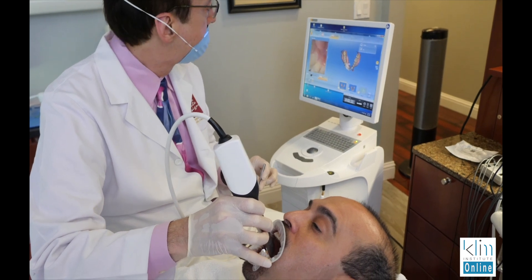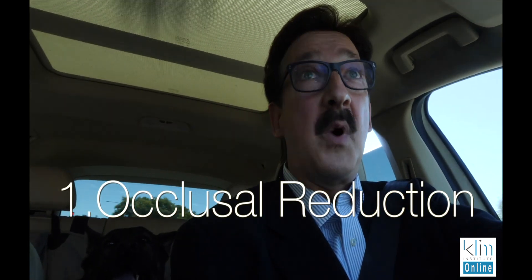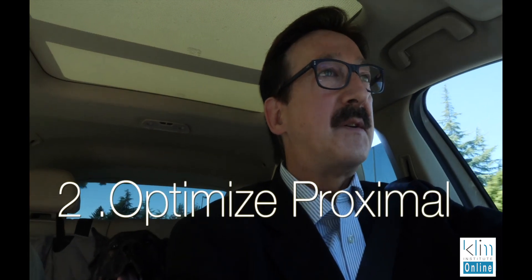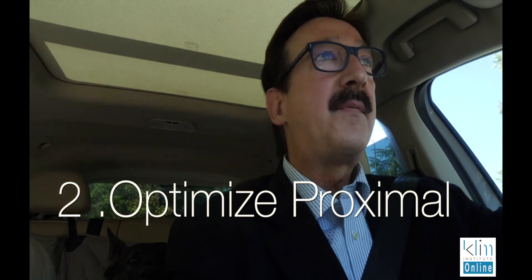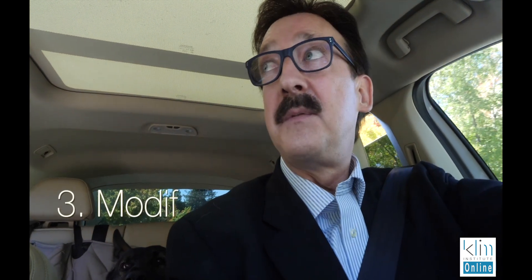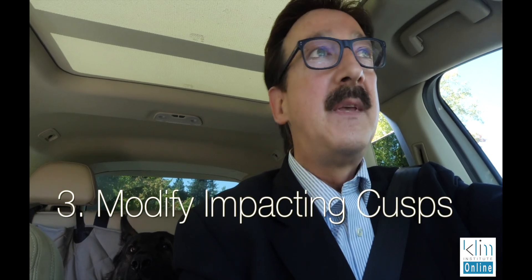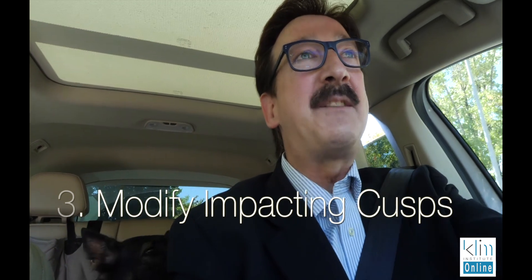Before I ever put an image into the unit, there are three things: occlusal reduction — and you've got to know what material you're going to use, usually before you start. You want to optimize your interproximal embrasures to create good interproximal health — no food traps, no point contacts. Then you've got to look at the opposing arch: are there impacting cusps? Because if there are, you're going to be compromising your function. Biofunction is always first in my clinical theater, and whenever I overlook that element, that's when I struggle.